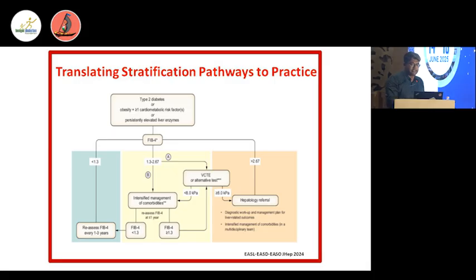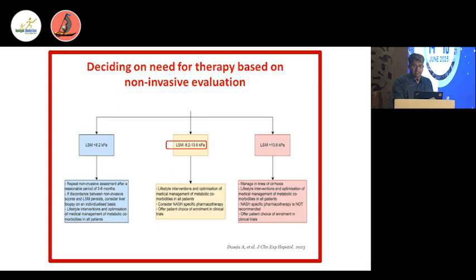Another liver technique is MR elastography. I think there are only 2 places in West Bengal which are doing MR elastography. So what you have is a passive driver like in the FibroScan machine, but it's made of plastic, obviously, since it's an MR machine. There is a conventional MR image of the liver, and this passive driver keeps on giving these impulses. The wave is generated and it is calculated into an elastogram.